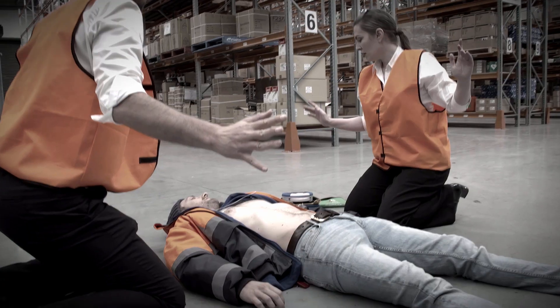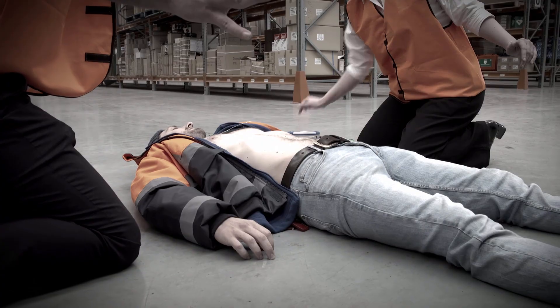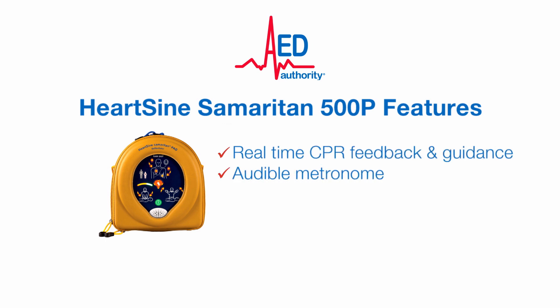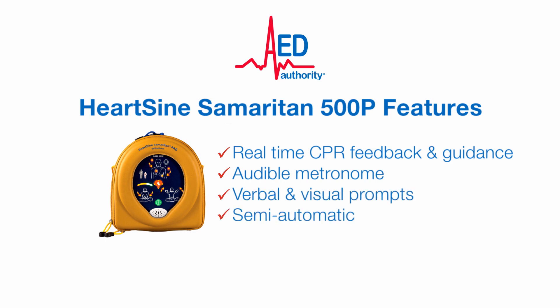For further information on the HeartSign 500P defibrillator and to see how simple the device is to use, keep watching — it may just save a life. The HeartSign Samaritan 500P features real-time CPR feedback and guidance, an audible metronome, verbal and visual prompts, and is semi-automatic, meaning the rescuer controls when to shock the patient.